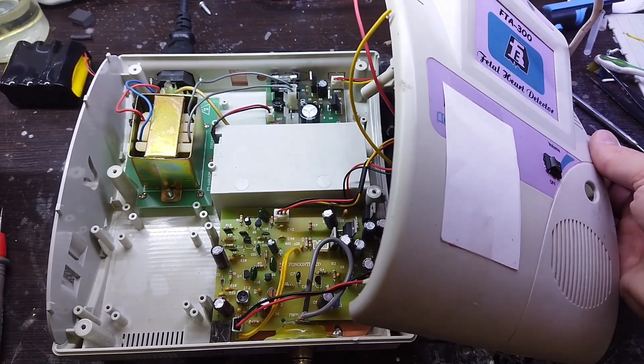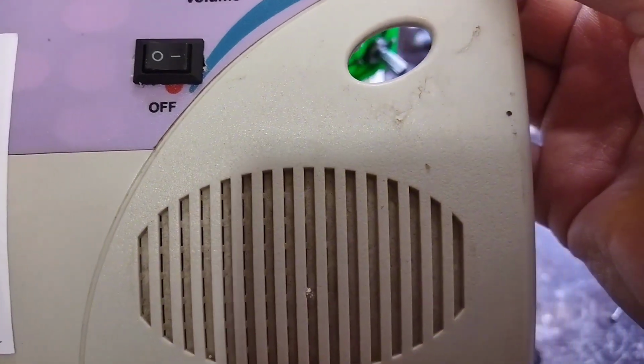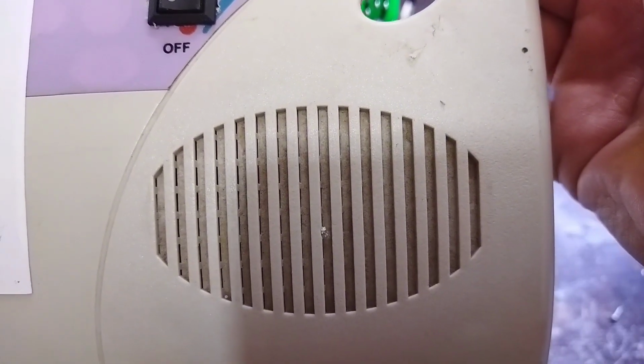After taking out the IC and replacing it with a new IC, I put the device probe on my heart, and we can see that the sound of my heartbeat is easily heard.